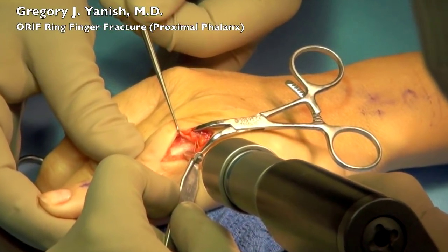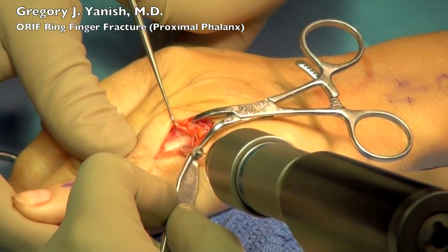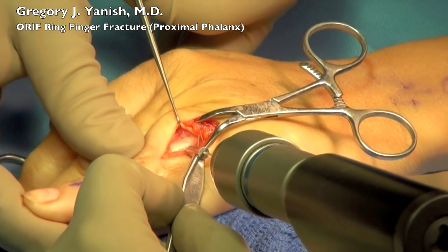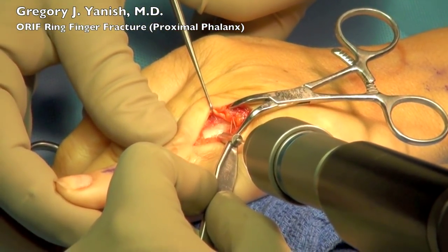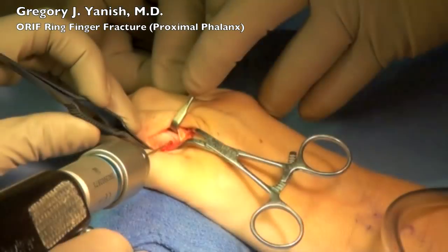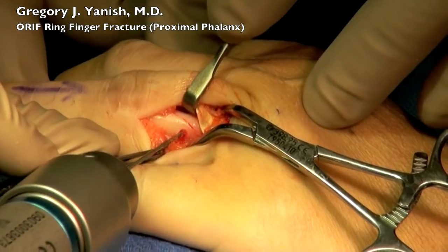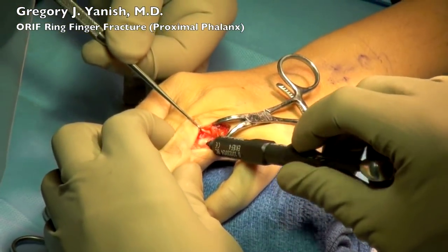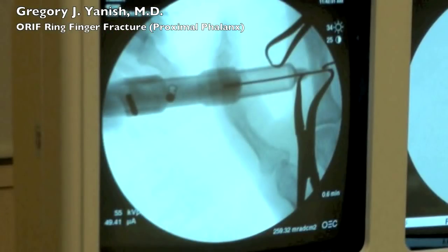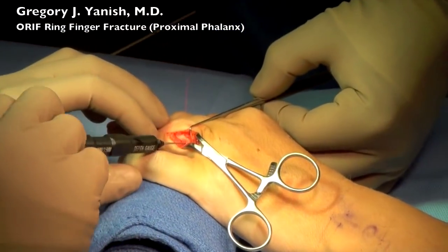Now I'll be using a drill to drill across both fracture segments and I'm going to be doing a lag screw technique. This is where I use a small drill bit to drill across both walls of the bone and then come in with a second drill bit which is slightly larger — the same size as the threads of the screw — and drill only the first wall of the bone, the proximal cortex. I then use a depth gauge which is extremely small to measure the length of the screw, and I confirm that on x-ray.